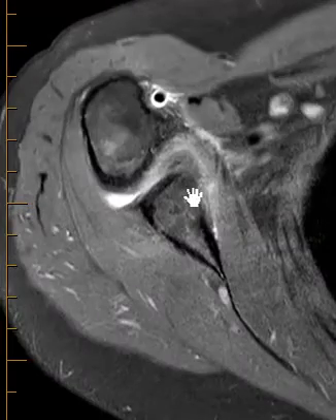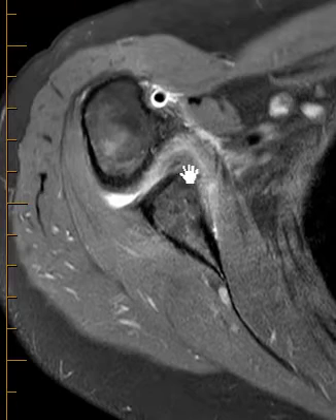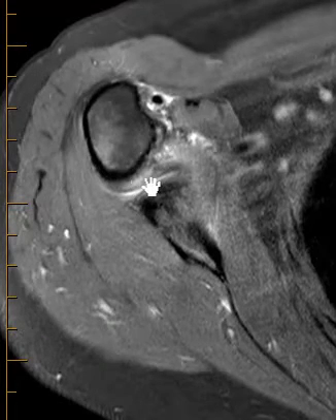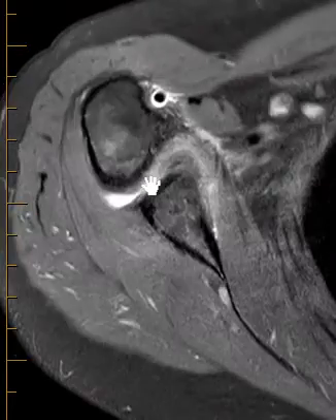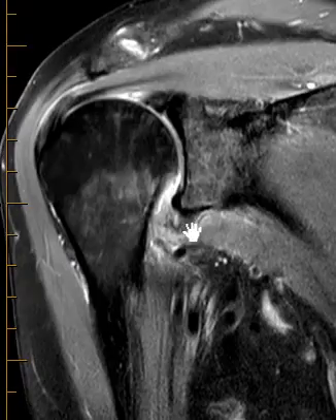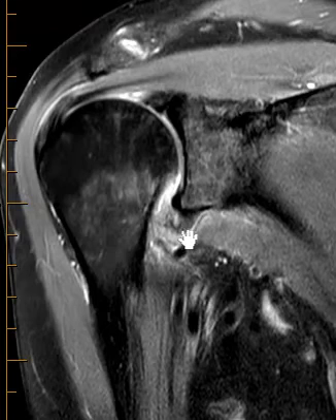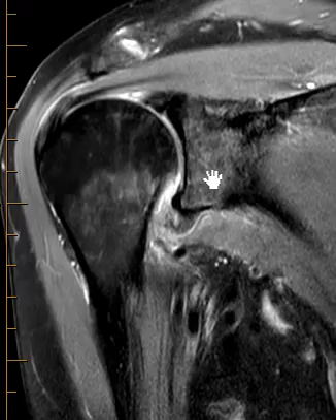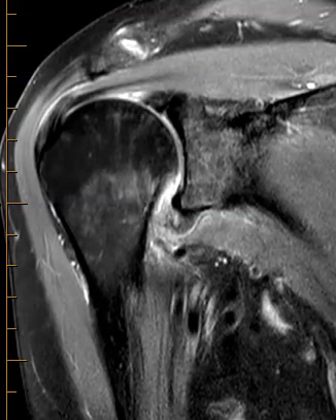So again, this looks like an anterior capsuloperiosteal stripping with a little tear of the anterior inferior labrum, and then the tear of the inferior joint capsule and the inferior glenoid and humeral ligaments. Again, that's the HAGL — humeral avulsion of the inferior glenoid and humeral ligament — that you hear about but hardly ever see. But this is what they look like right here: it comes across, seems to end blindly, and it can be really difficult because there's scar tissue. Anyway, thank you very much, hope you have a great day.